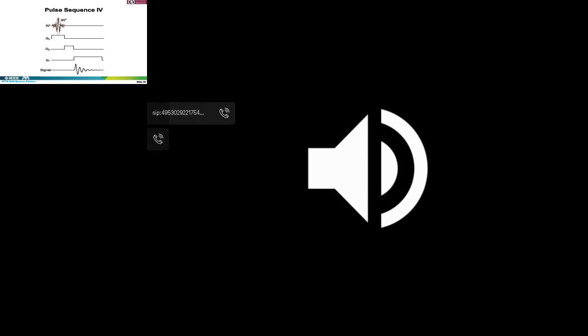The second one is the pulse you need for phase coding. The third one is the pulse you need. Pulse means now the ramp itself. You need it for the frequency coding. Frequency is related to Y, phase is related to X, and now you acquire the signal or measure the signal coming back from the body.